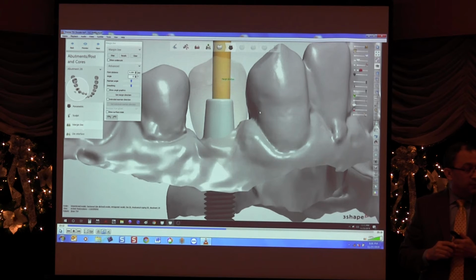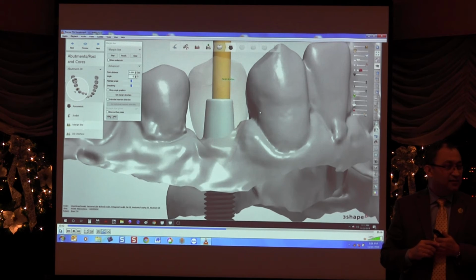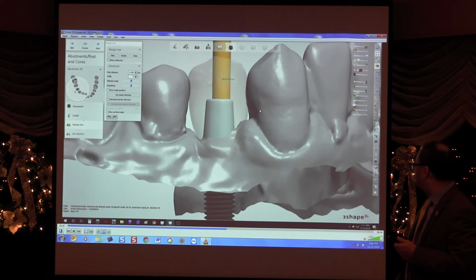As much as I love Schwab and as much as I love 3Shape, there is the real world out there. You may have a boutique lab that you want to do business with. As of last year, the Trios now can scan an STL, and you could send that to somebody if they had a Zirkonzahn or an Amann Girrbach system that uses exocad and doesn't use 3Shape. You now have the ability to send them that STL file so that they can work with it too.